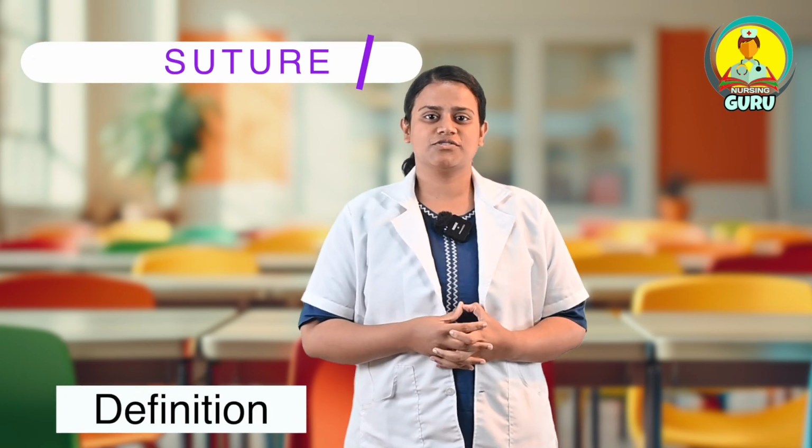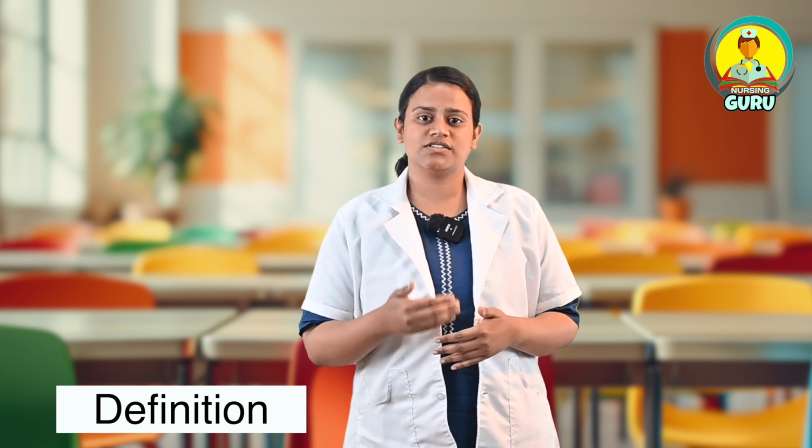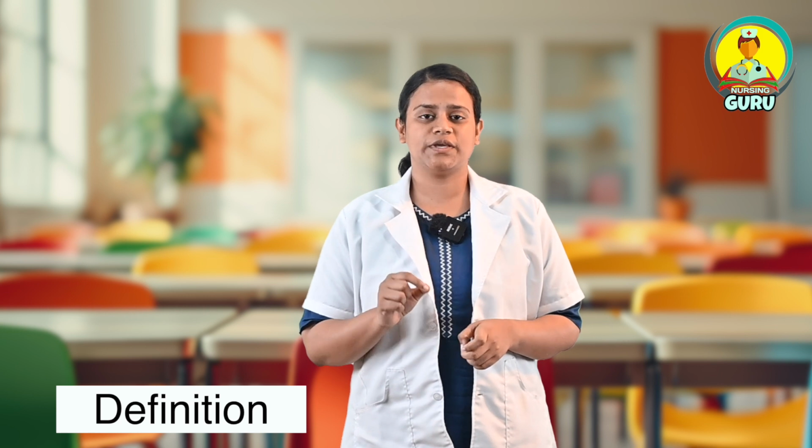Definition of suture. Suture is a stitch or series of stitches which is made to secure the apposition of edges when there is any surgical wound or any traumatic wound. Apposition, A-P-P-O-S-I-T-I-O-N, means bringing something close or side to side. So here we are using some suture materials for suturing.